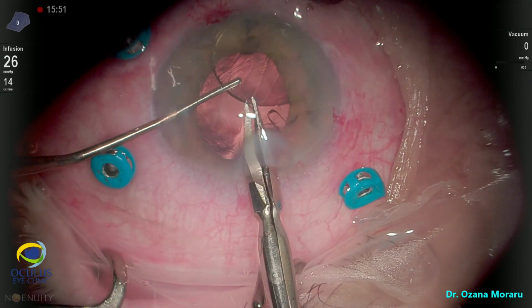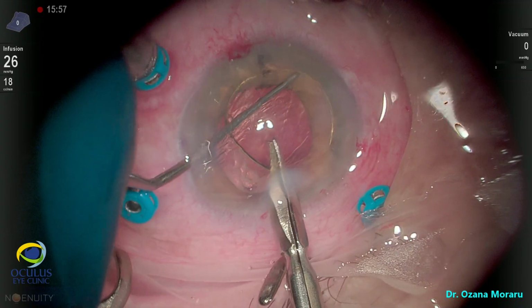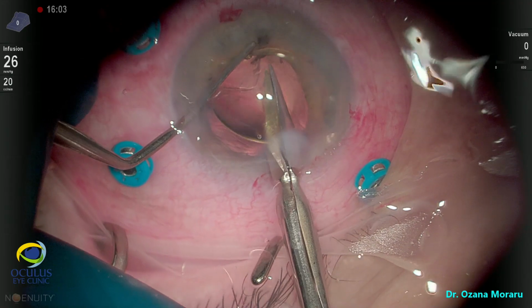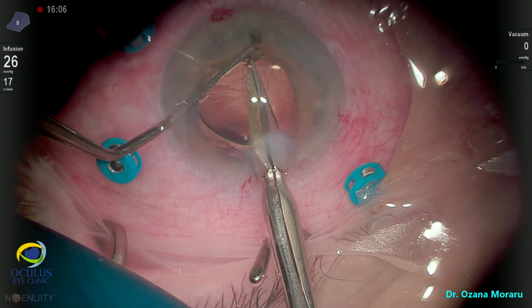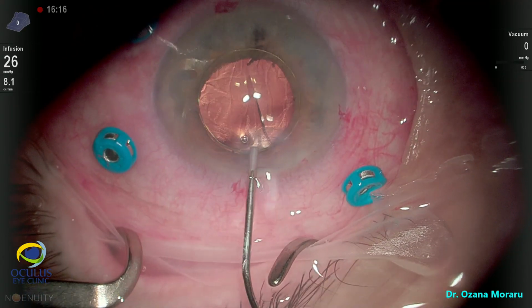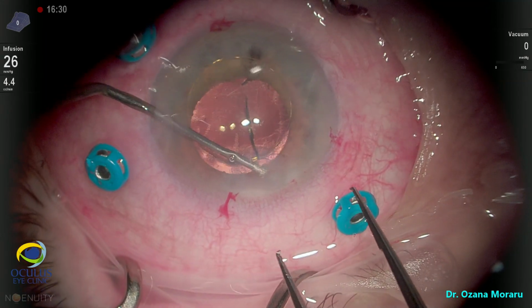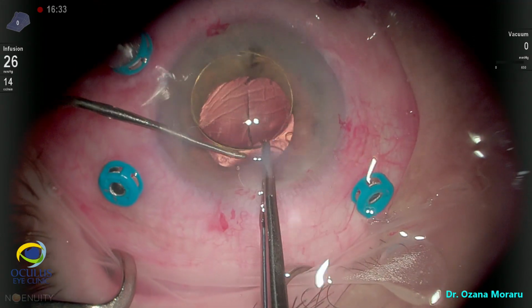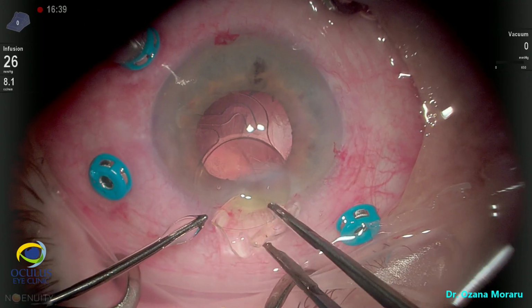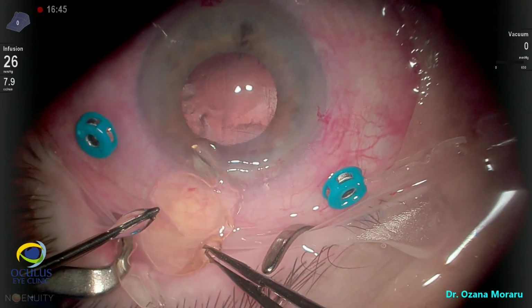So we want to cut it into pieces, but not completely, because we don't want to lose those two halves again in the posterior segment. So we cut it using normal Vannas scissors, only two-thirds or three-quarters of the diameter of the optic of the IOL. Again, OVD protects the cornea, and now with simple teeth forceps, by rotating maneuvers, we remove the IOL from the anterior chamber and from the eye.